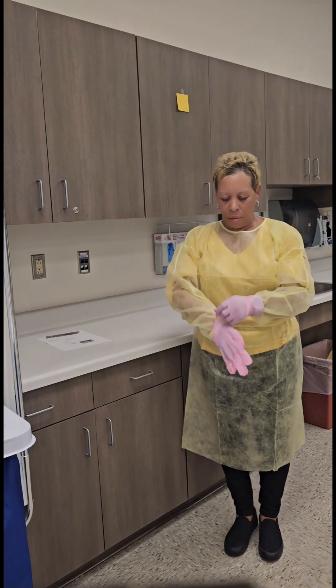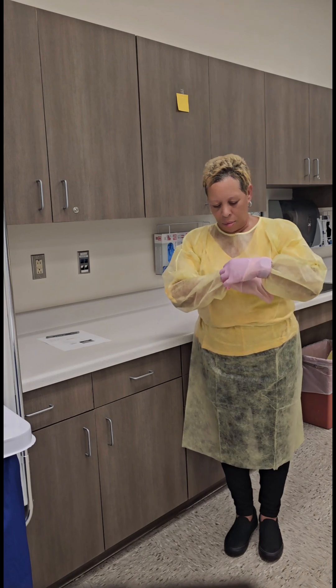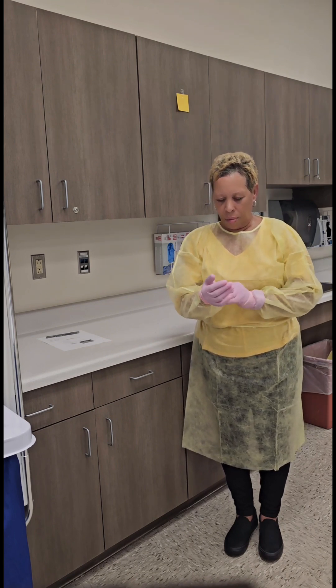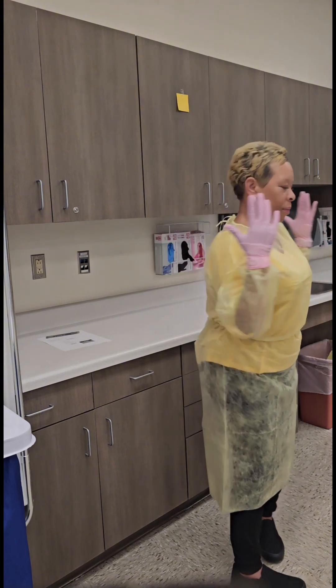Pull the cuff of the sleeve midway your palm — this will make it easier when putting on your glove — ensuring that the cuff of the glove is over the gown.